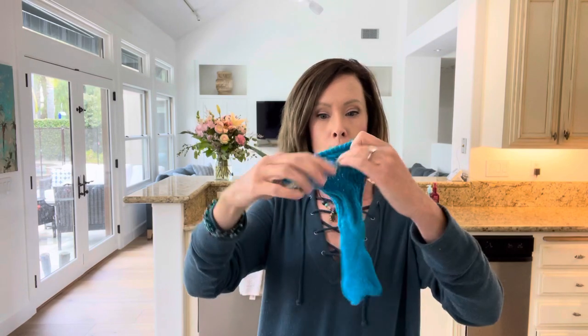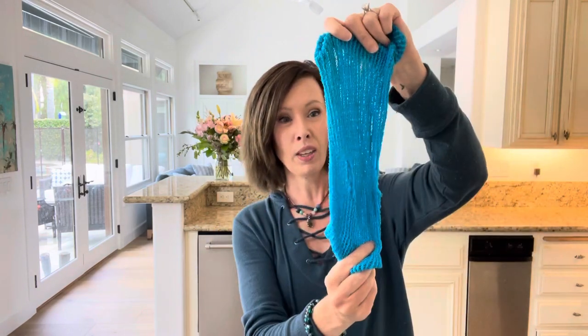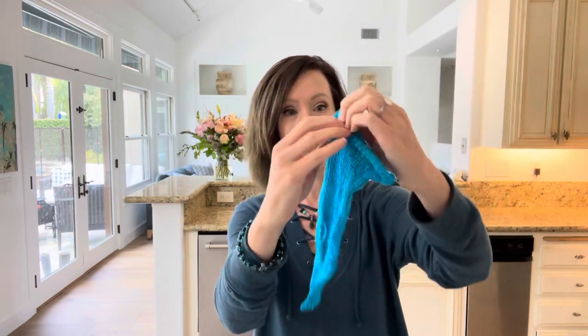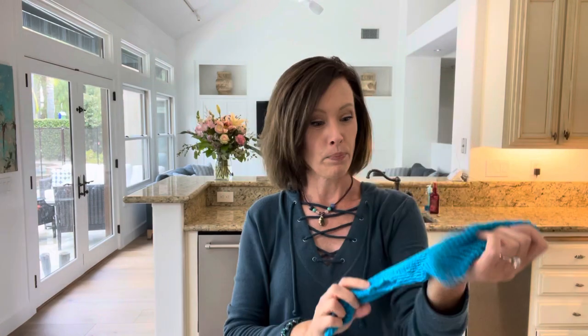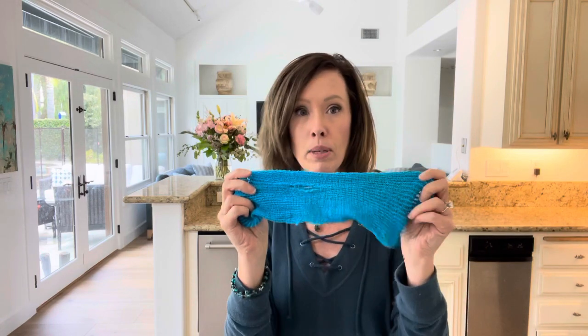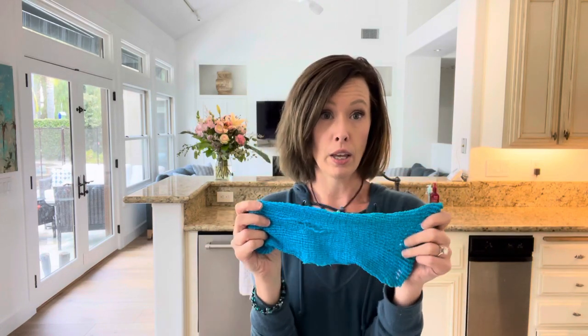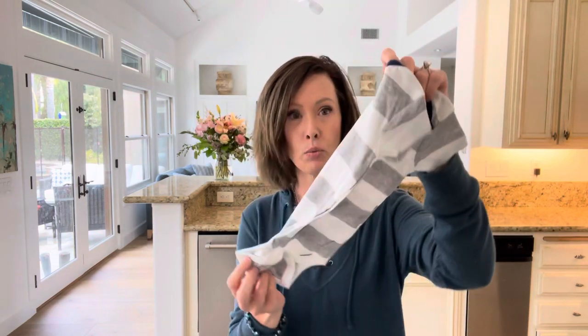When they first get their feeding tube, the vet — at least our vet — puts them in a really stretchy fishnet-type material. Being a hairy dog, this is not super comfortable; his fur bunches up in it and gets itchy. I left him in this for a week or two just to let the site heal, and then I switched him over to onesies — little baby onesies.